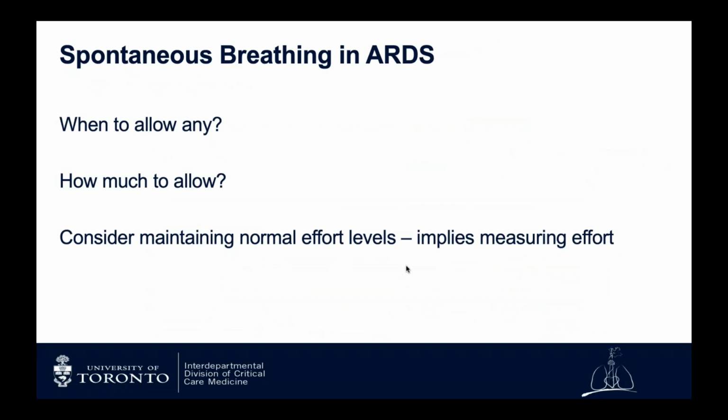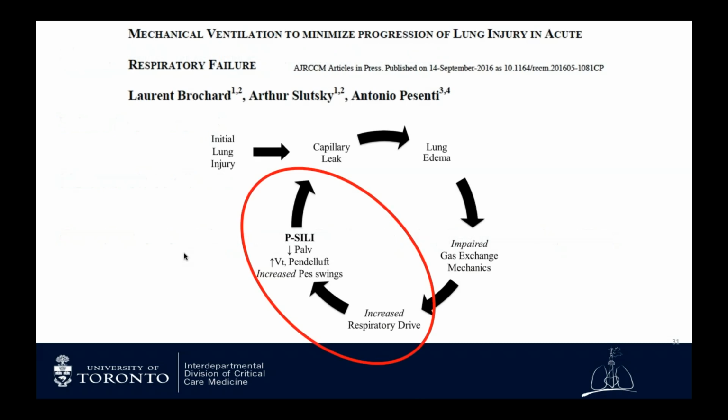So switching gears in the last 5 or 7 minutes or so to talk about spontaneous breathing in ARDS. It's an ongoing subject for debate in all patients, but also applies to our patients with COVID-19, some of whom seem to have a very strong drive to breathe. And questions exist like when to allow it, how much spontaneous breathing to allow. And if we're considering targeting normal efforts, that also implies that we actually need to measure patient effort.